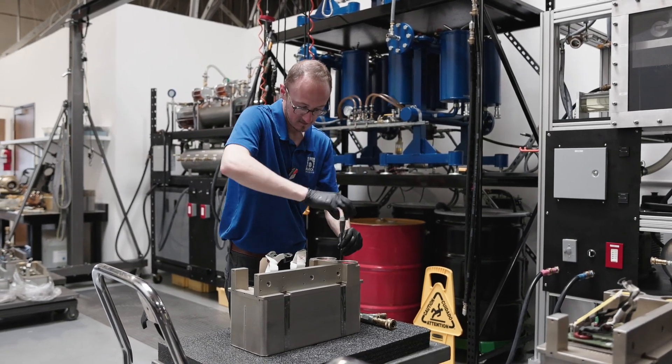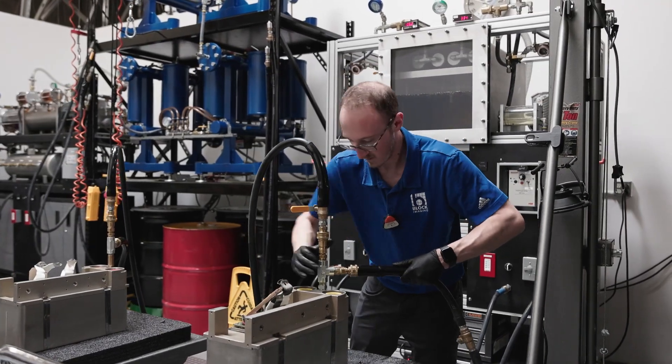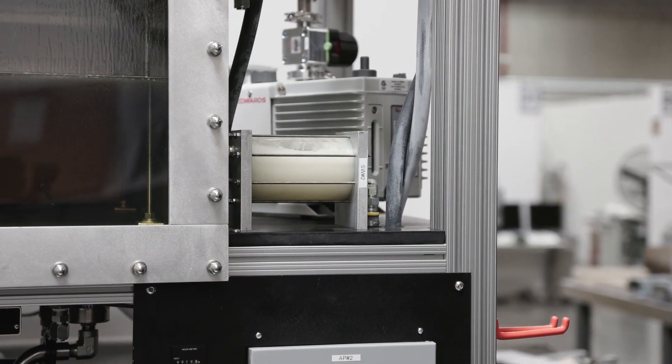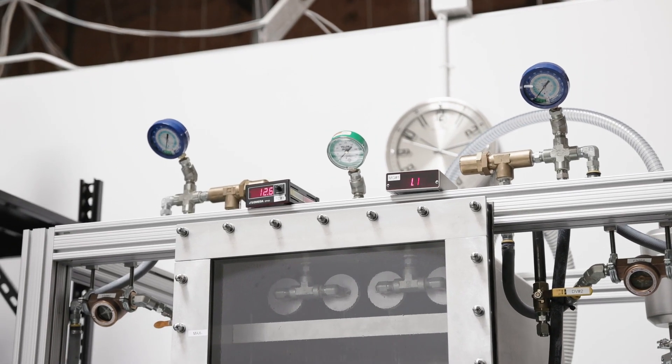X-ray tube manufacturers can provide a brand new tube housing with a new insert. In concert with original equipment manufacturers, we're able to buy those inserts and provide you with a good quality used housing that's been refurbished, keeping costs around 20% lower compared to a new tube.